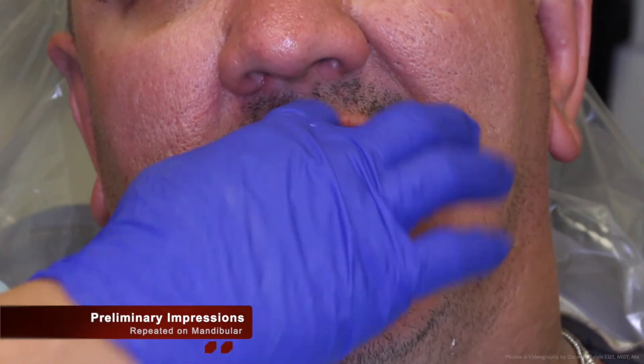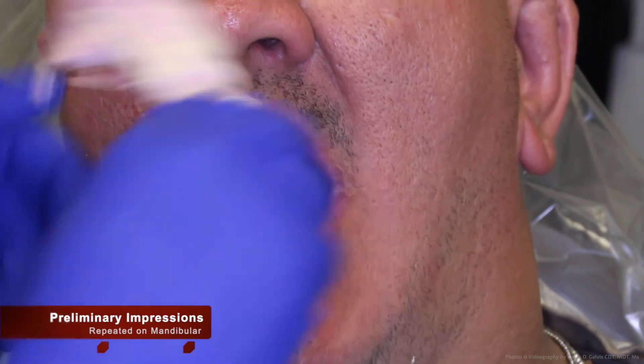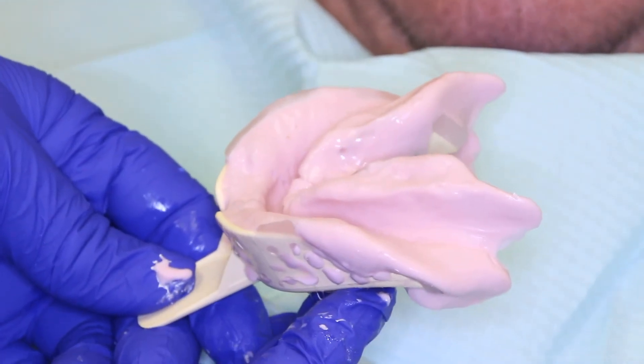These same procedures are then performed and repeated on the mandibular arch.